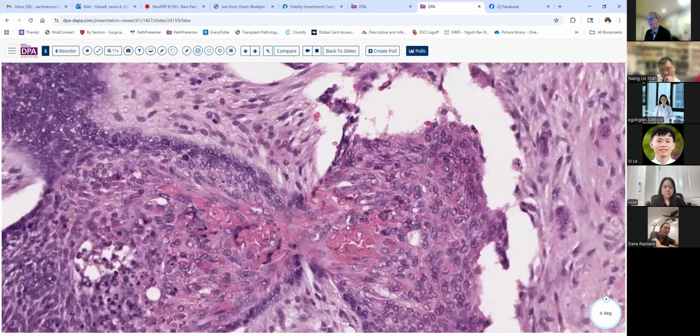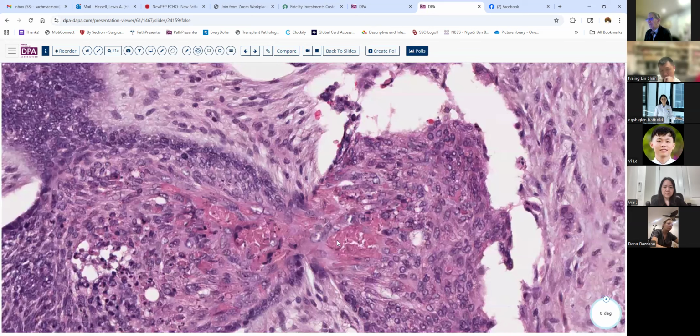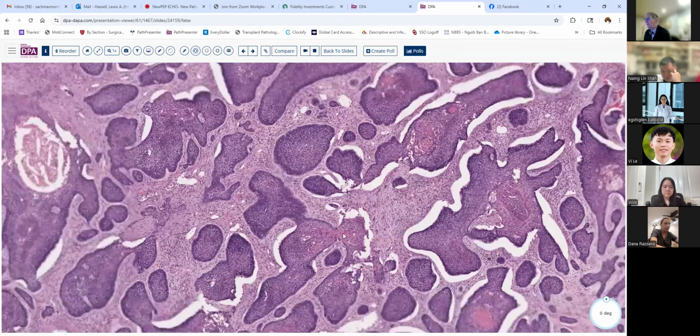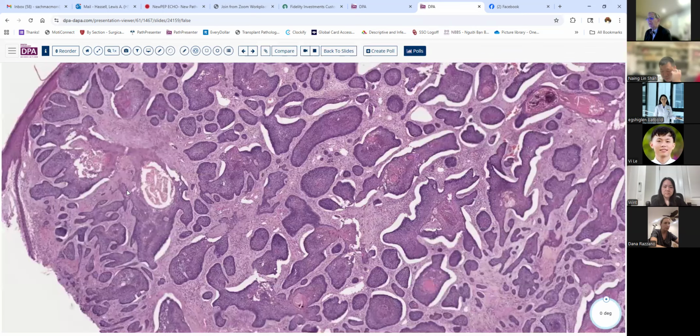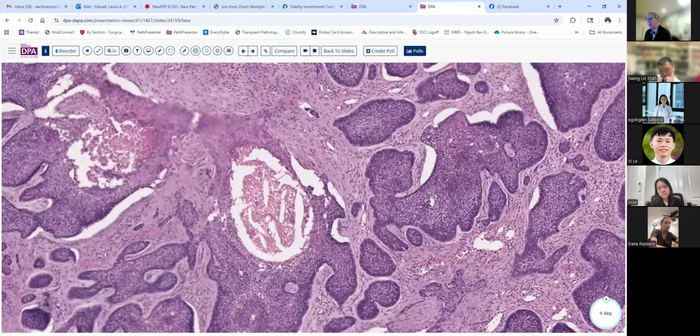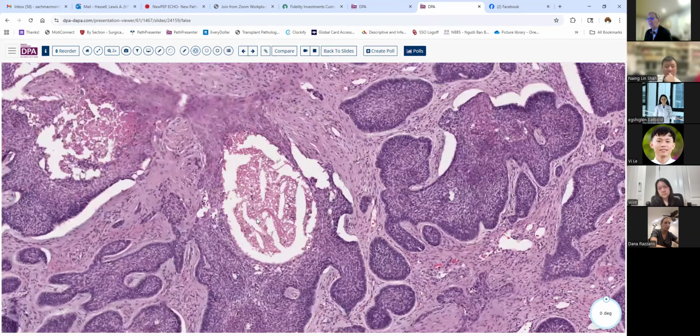Sometimes it can be so eosinophilic that you wonder if these cells are keratinizing. So you might see cells like this and wonder if this is a keratinizing lesion, because squamous cell carcinoma is much more typical to produce keratinization and cystic formation secondary to that keratinization.